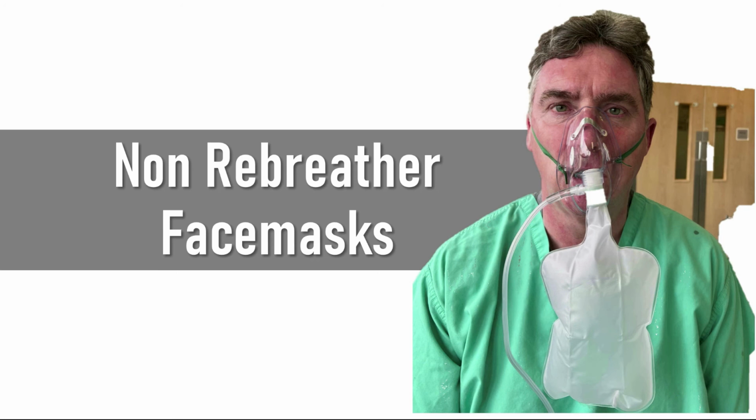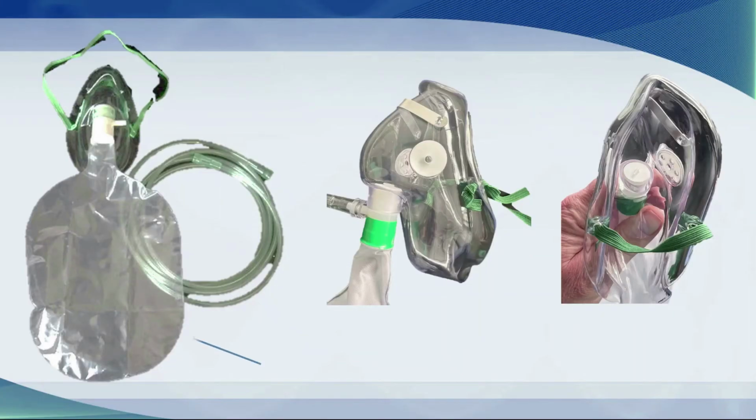And the key component of this is that bag that's sitting in front of my chest, and it's known as a reservoir bag. Now, you will be familiar with devices that look like these. You may have put them on patients, you may have seen them on TV, and certainly if you've ever been in an airplane when the flight attendants are demonstrating what happens in emergencies. They will say, well, if the cabin depressurizes, these masks will come out of the ceiling. Put them on yourself first before you put them on somebody else.